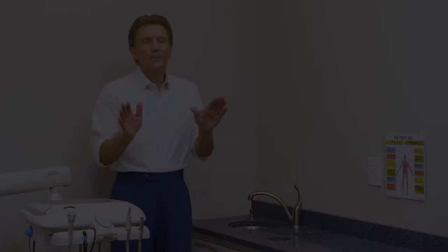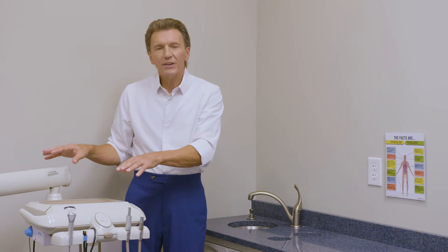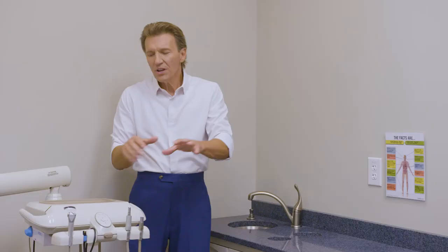Now that we've established that dual head entry is the most efficient way to get into and out of the operatory, let's talk about delivery units. Delivery units deliver things like compressed air, vacuum power, and multiple accessories that allow you to efficiently provide dental services. For example, this is a unit manufactured by Midmark — the Pro Center left-right unit, which swivels around the chair in either direction to support right-handed or left-handed operators.